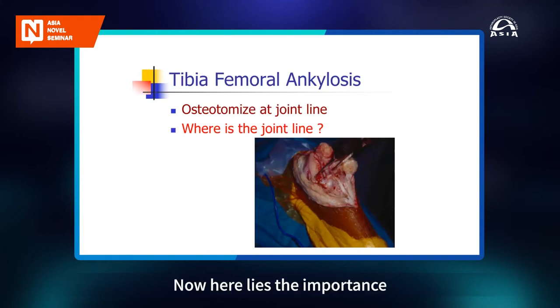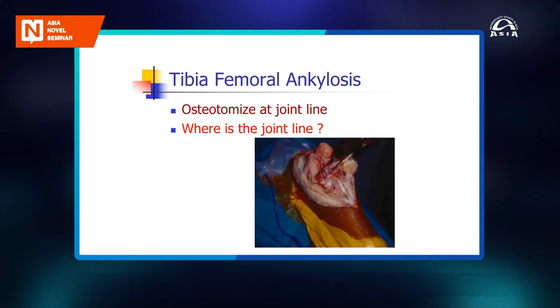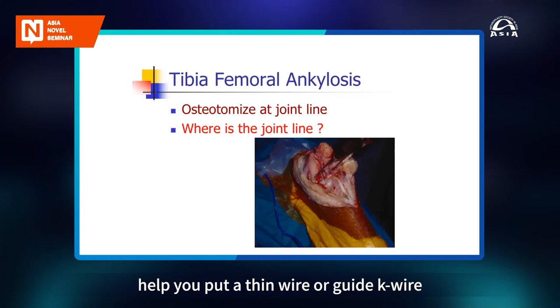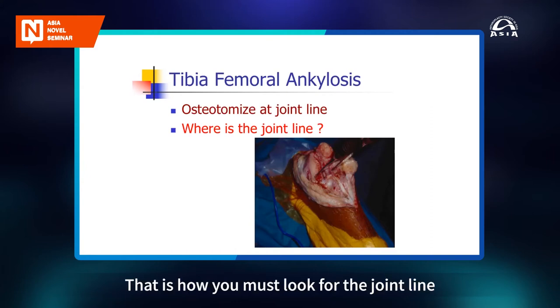Now, here lies the importance of having an image intensifier in your OT. If your OT is sharing it with another OT, make sure you have it, because this can sometimes help you put a thin K wire or guide wire and see where you are and how far you are. You can put one guide wire into one of the epicondyles, take a metal scale and measure it with another one under image intensifier. That is how you must look for the joint line.